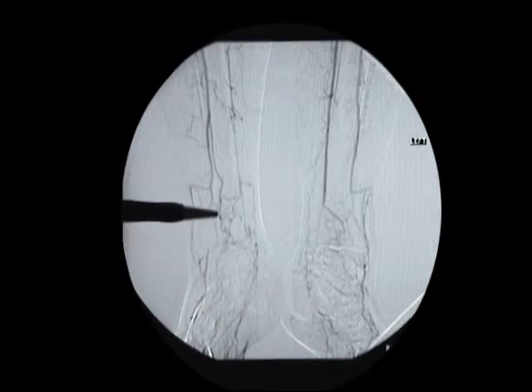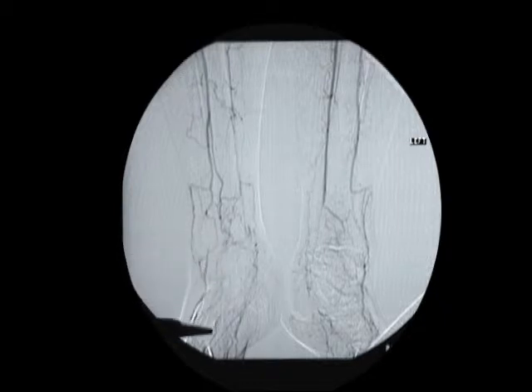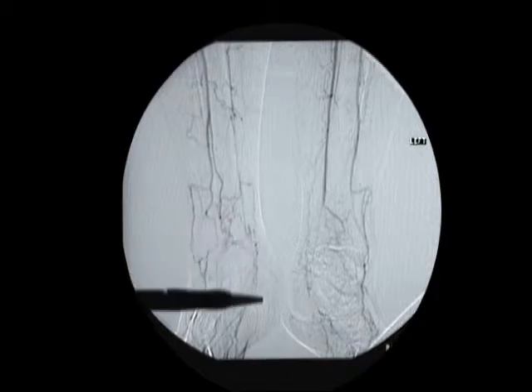We'll start within a centimeter of the termination of the branches of the peroneal artery and extend densely over the dorsalis pedis distribution as well as over the posterior tibial artery distribution.